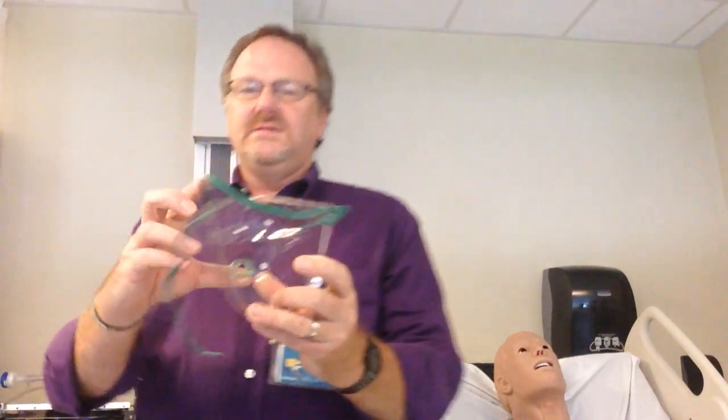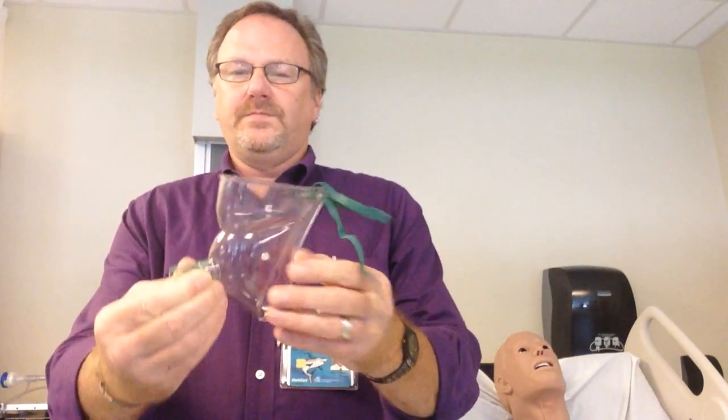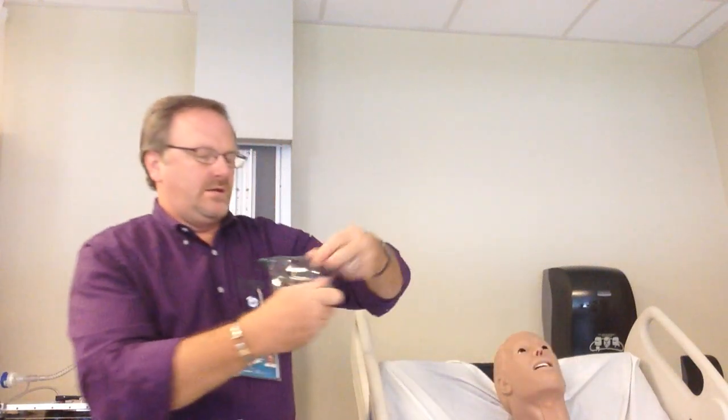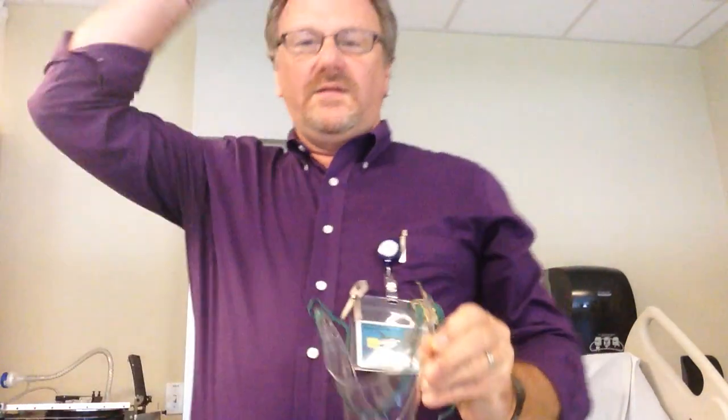The face tent will come in a package and look something like this. You put it on the patient by opening it up, placing it over the face, and putting the strap on so that the strap goes around the head.